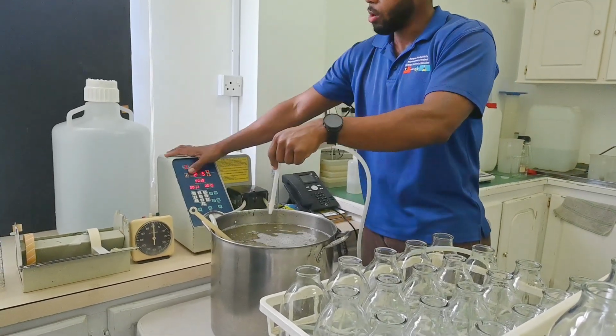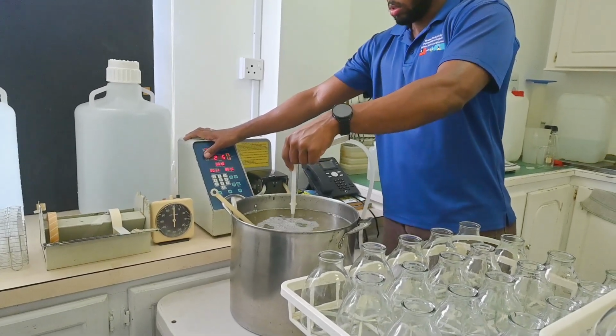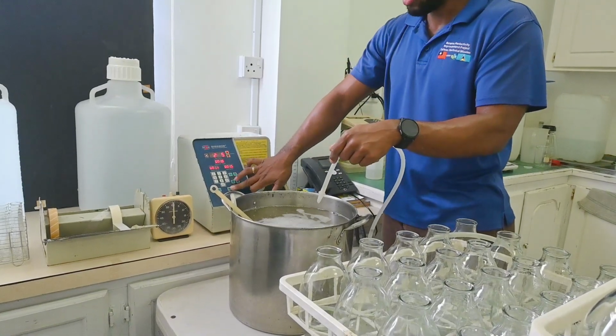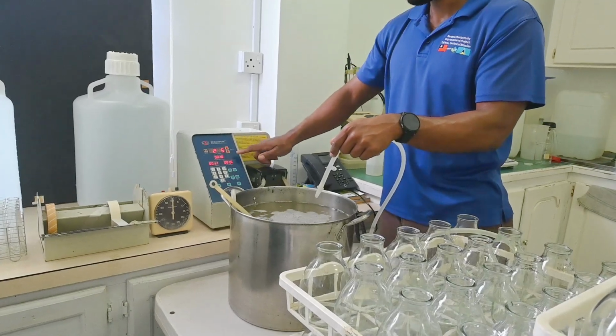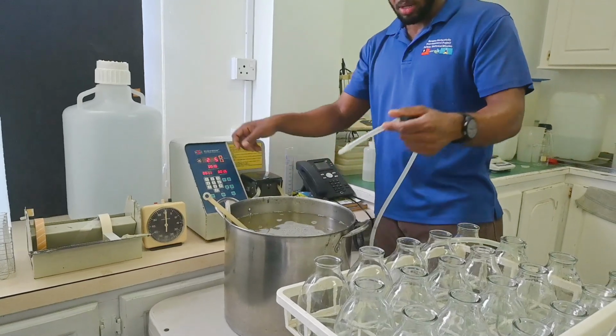So you're going to place it on. So now that the line is full, I'm going to place it on auto. I already put the settings for the dispense rate, the flow rate, and the time. So we're going to do an example.